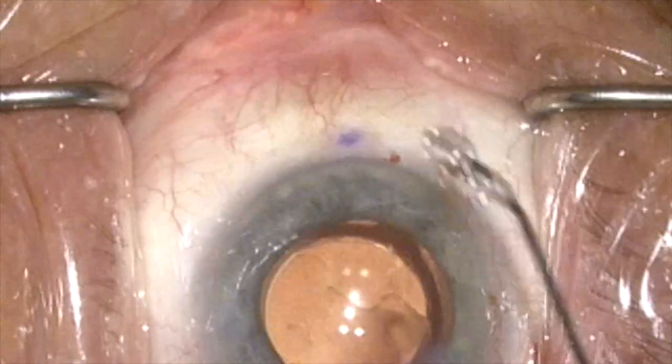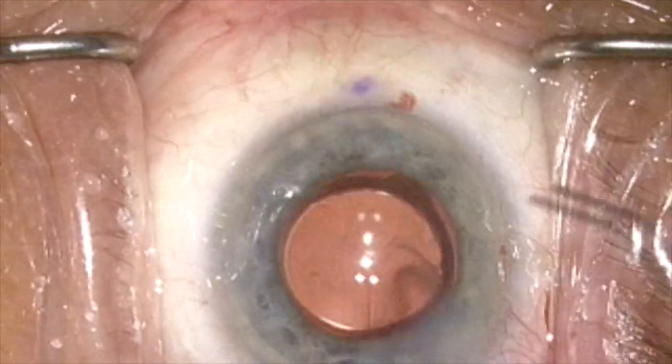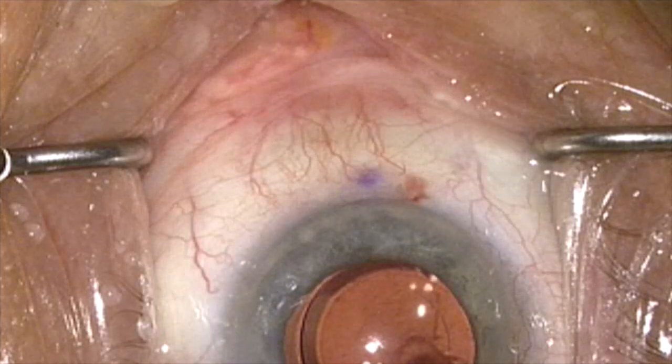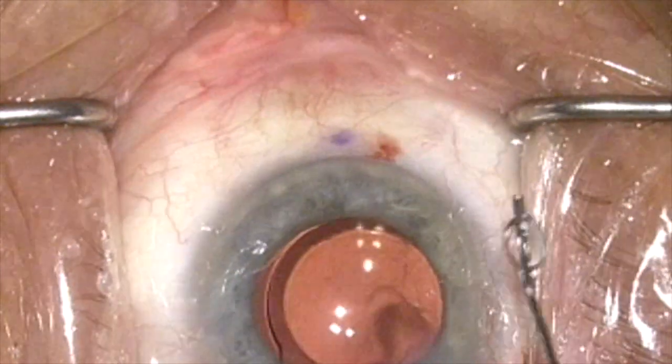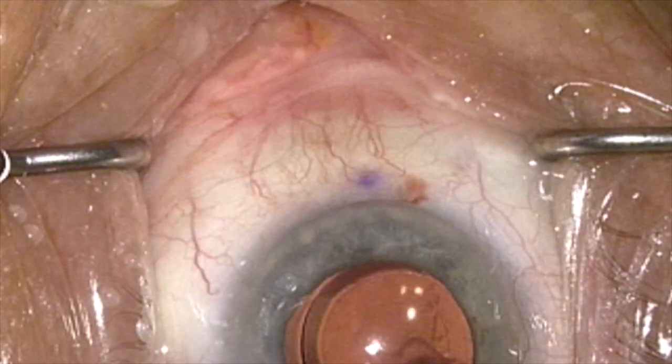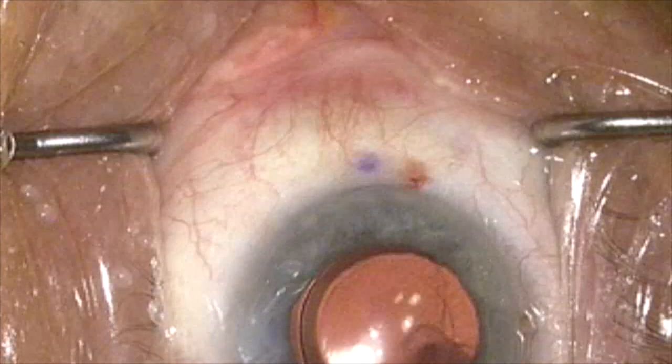When we firm the eye up, we can see them blanch in the area where the eye stent has been placed. Here we'll soften it again, firm the eye up, and you can see the blanching of the perilimbal aqueous veins in the region of the eye stent, confirming its proper positioning in Schlemm's canal.